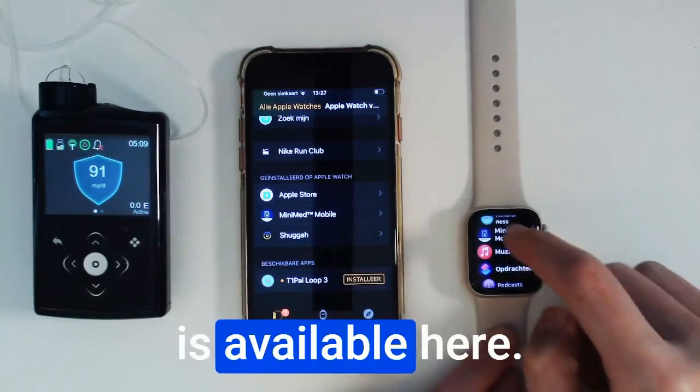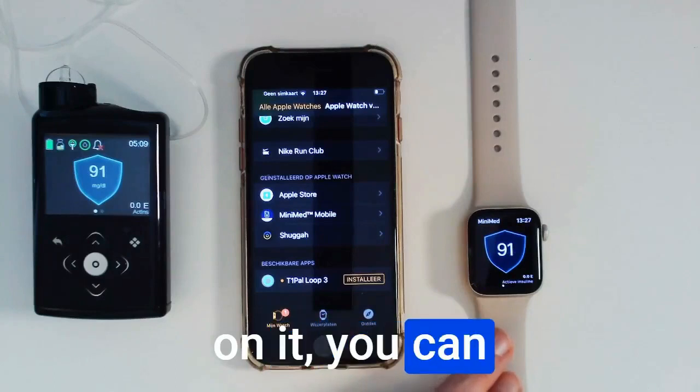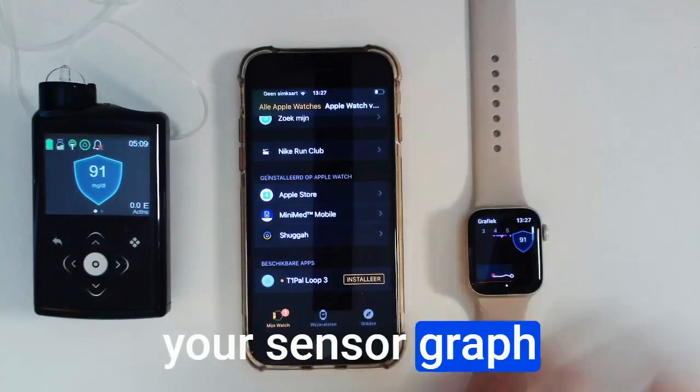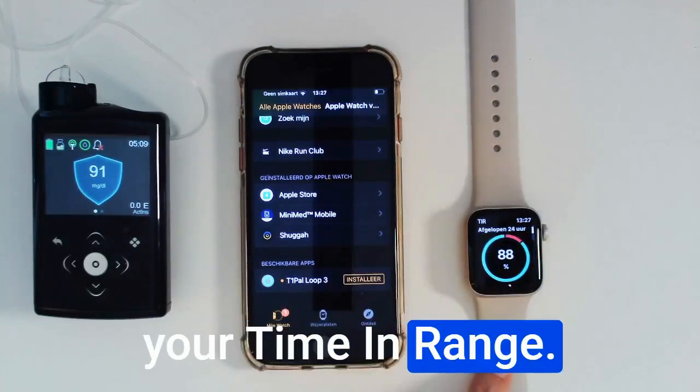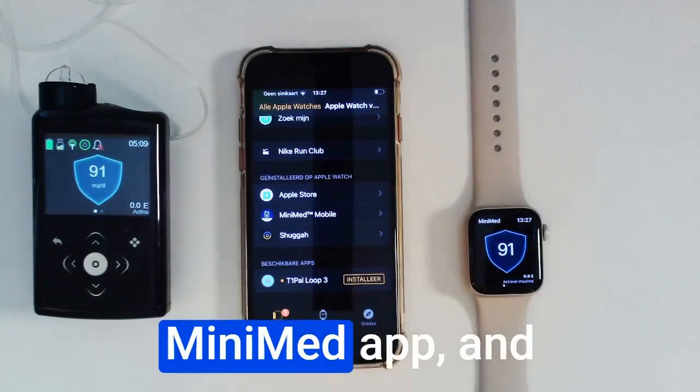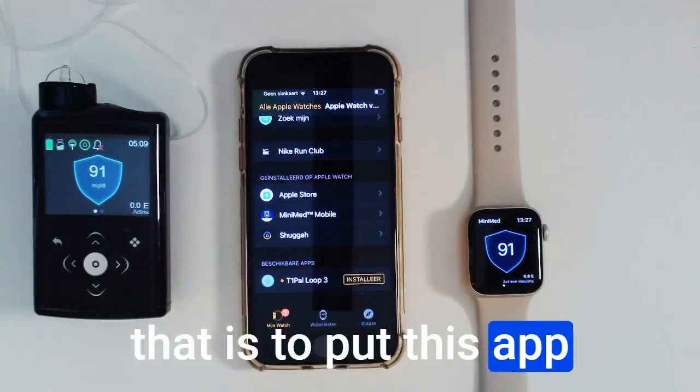If you click on it, you can see your sensor glycemia and your SmartGuard shield. You can also see your sensor graph and your time in range. There's also a possibility to have easier access to this MiniMed app, and that is to put this app as a complication in certain watch faces.